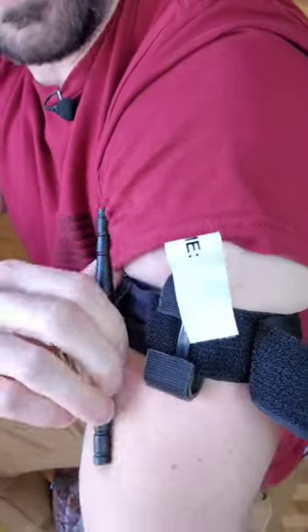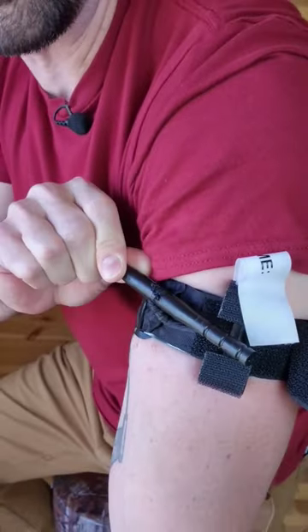And there we have it — the strap is broken. See that? Complete catastrophic failure right there.